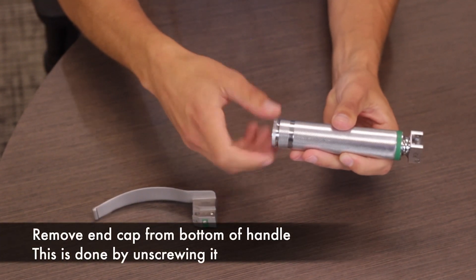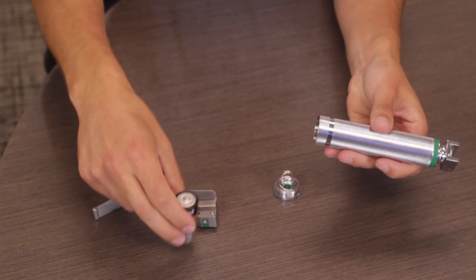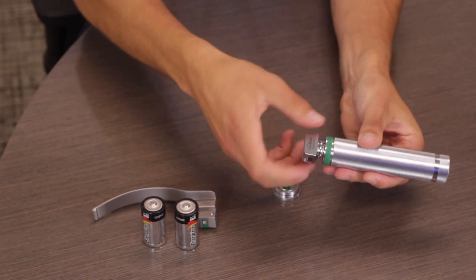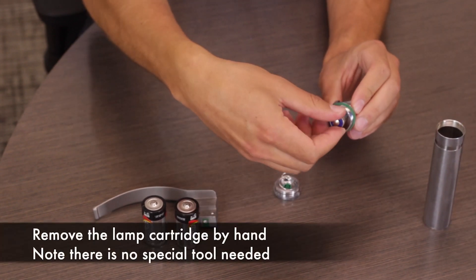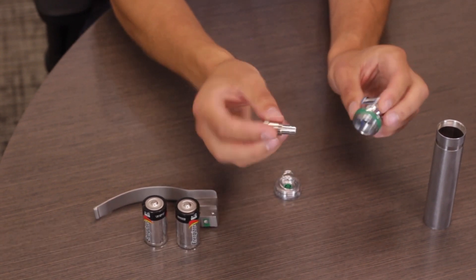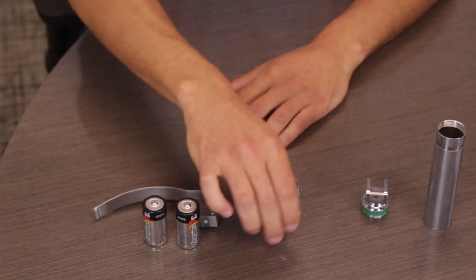Remove both C batteries. Once the batteries have been removed, unscrew the laryngoscope handle head. Inside you will find the lamp cartridge. This lamp cartridge can also be unscrewed by hand — note that no special tool is needed to remove it. Once the device has been completely disassembled, it is ready for cleaning and sterilization.